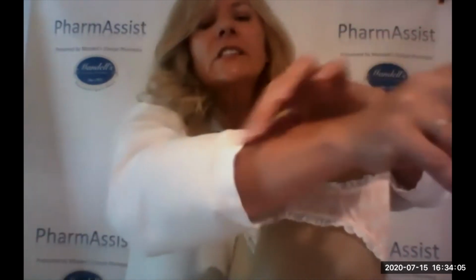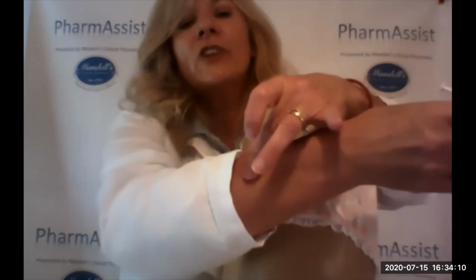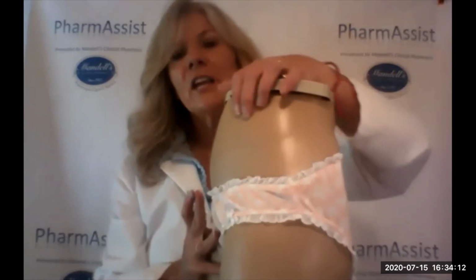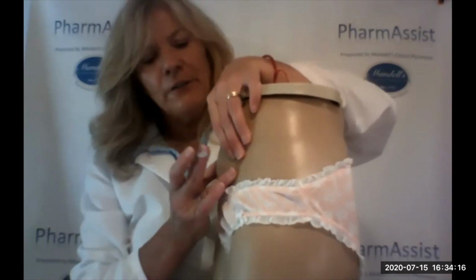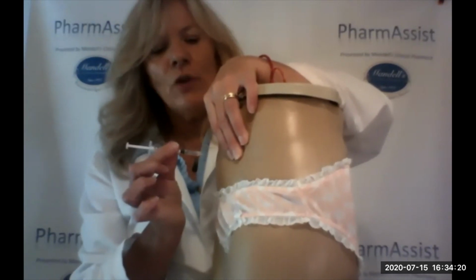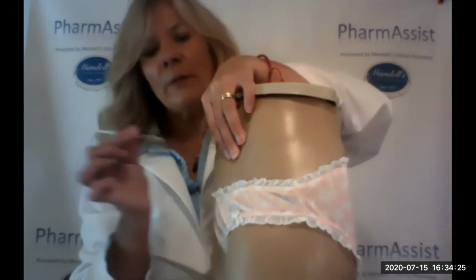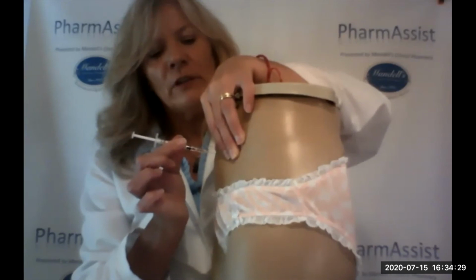So it's really just you're lifting the fatty tissue up off of the muscle, so it's a nice, just gentle lift. I like to kind of think of it as a lift versus a pinch. So we're going to give a little lift to that fatty tissue. We're going to angle the needle straight in, and we do not need to jab, okay? No reason to trauma the skin that way. Just place it gently to the skin, give a little pinch.